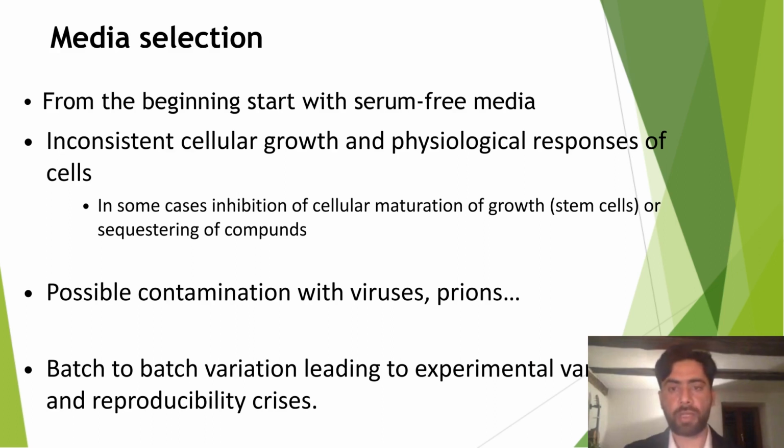Now, the media selection process, as I said before, it should be the serum-free media. And the serum-free media is essential because usually in the serum, there is batch-to-batch variation between each serum which we get. There's a possible chance of contamination within the serum itself. And usually the cellular growth and physiological responses of the cells is inconsistent in different kinds of serum. And not to forget here is also that certain compounds are sequestered in the serum itself.